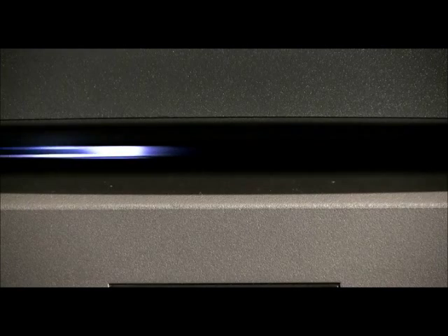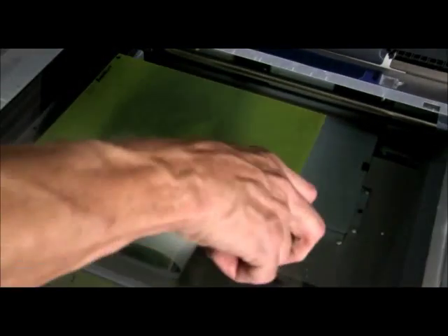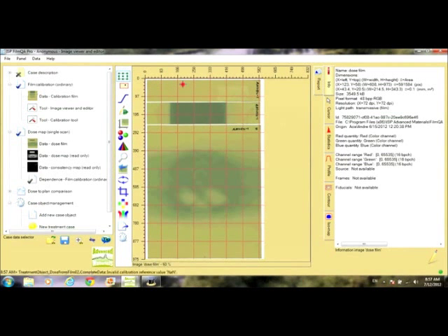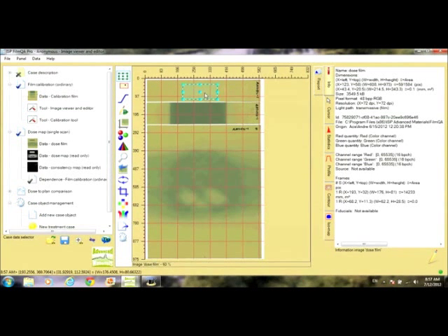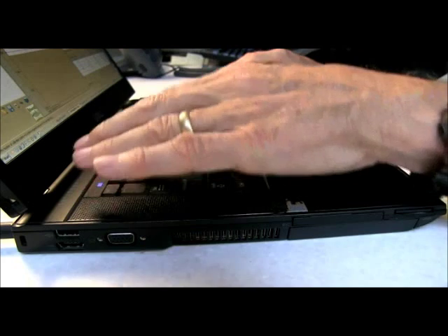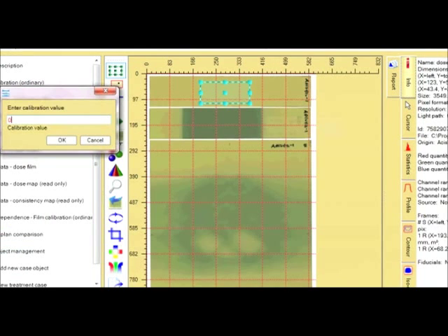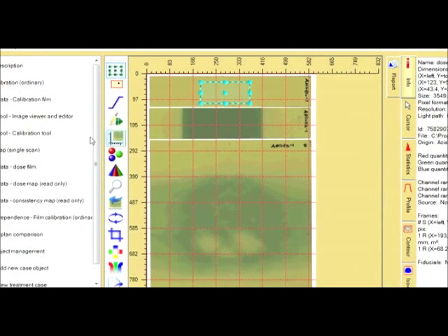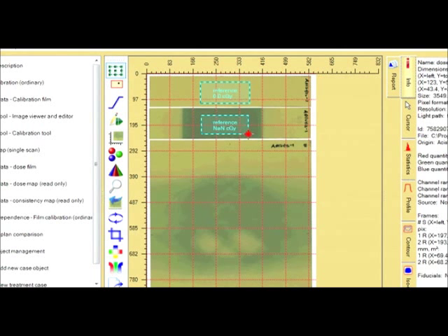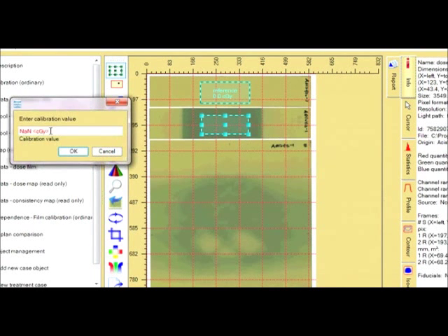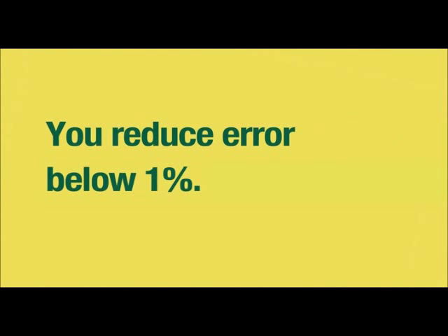Remember, when you scan the three films together, place them at the center of the scanner to minimize the lateral response artifact. Now, once you have the scan, you'll mark the reference films and enter the doses. When you scan the reference films and application films together, you're rescaling the original calibration. Actually, recalibrating each time you measure. And because the single scan eliminates inter-scan variability, you reduce error below 1%.